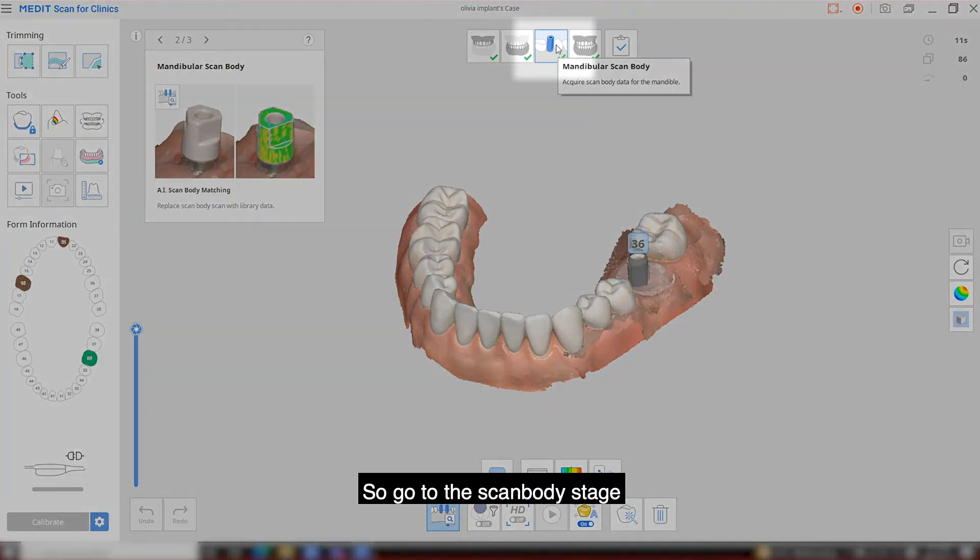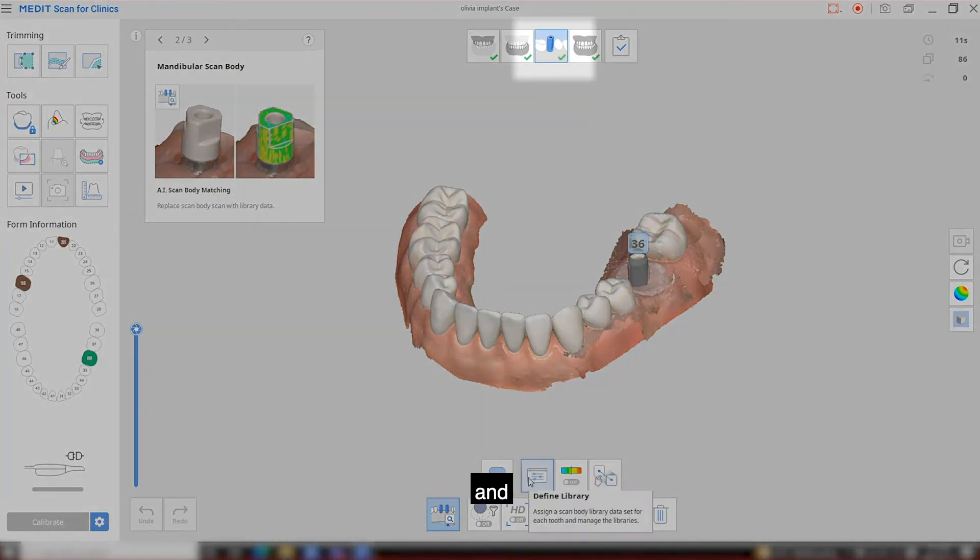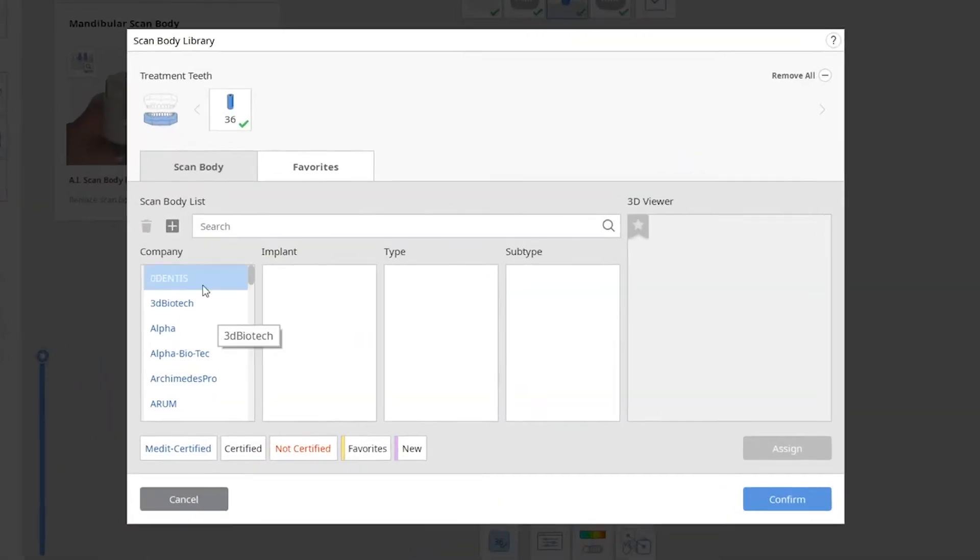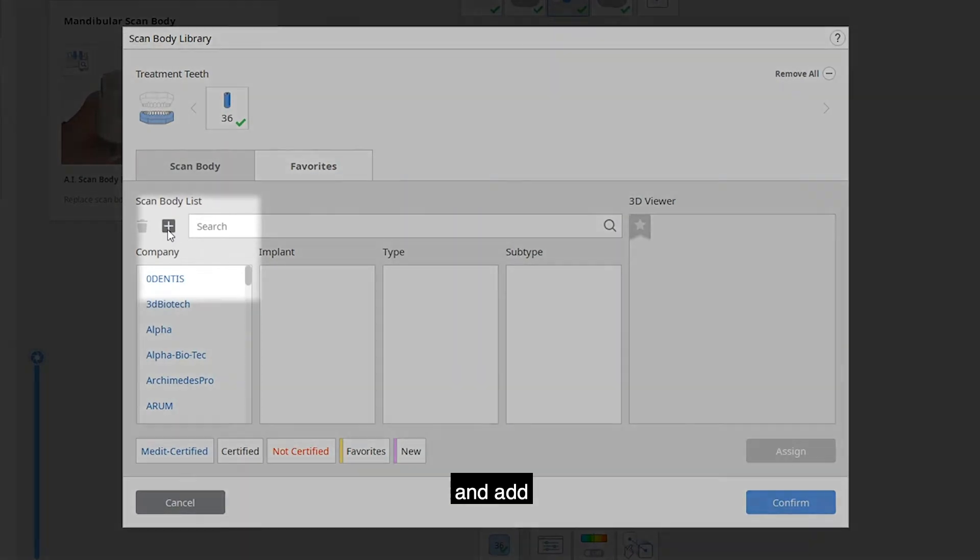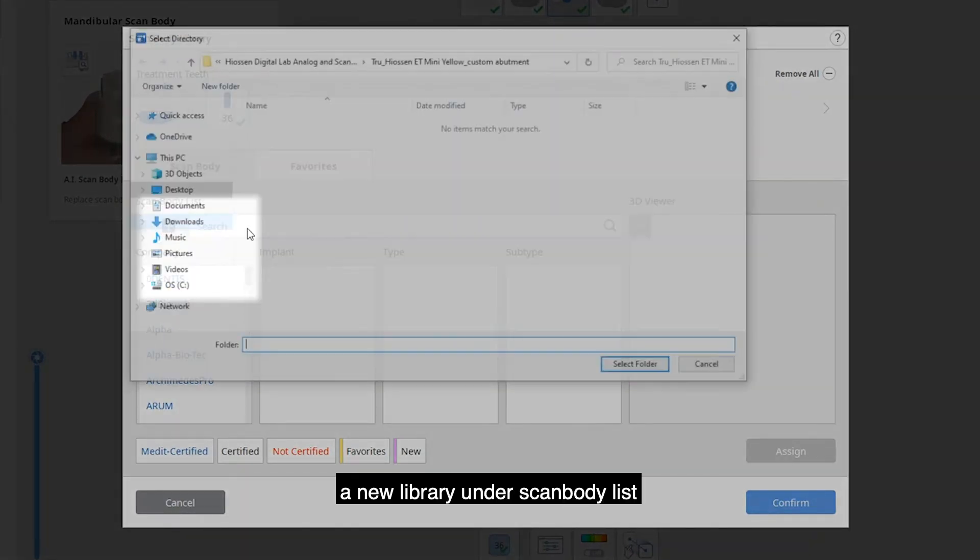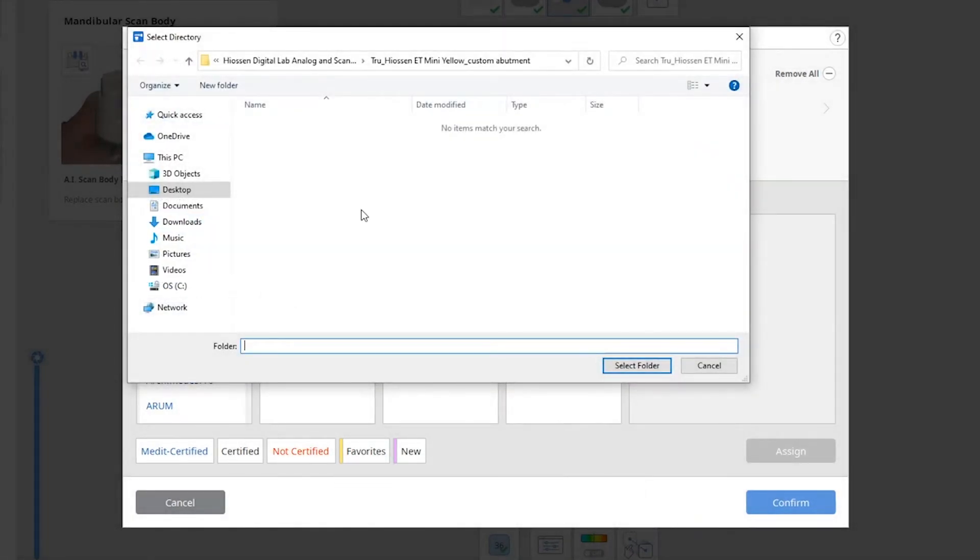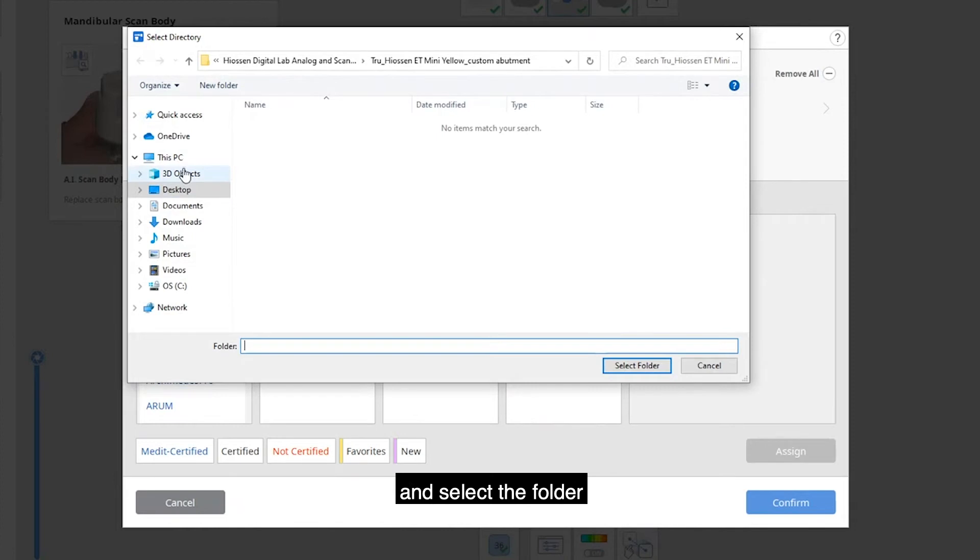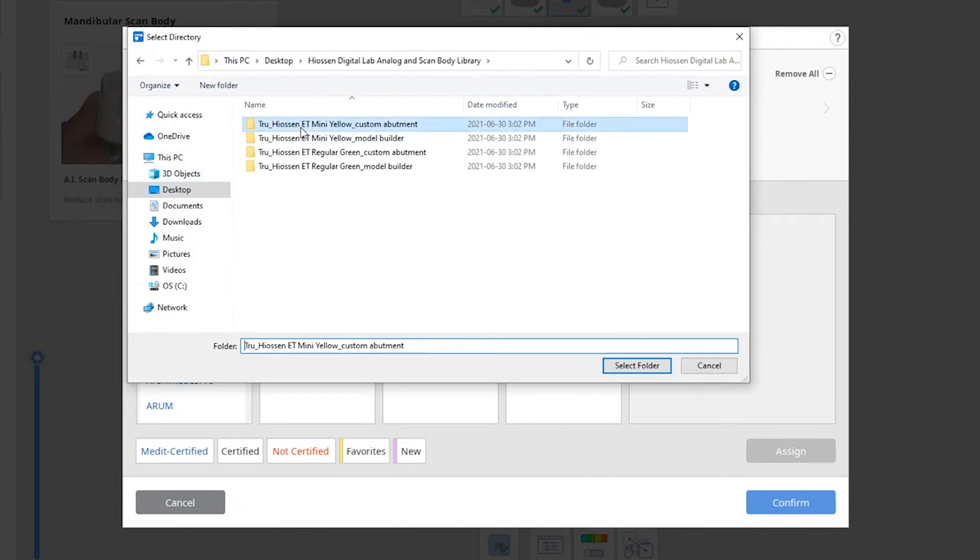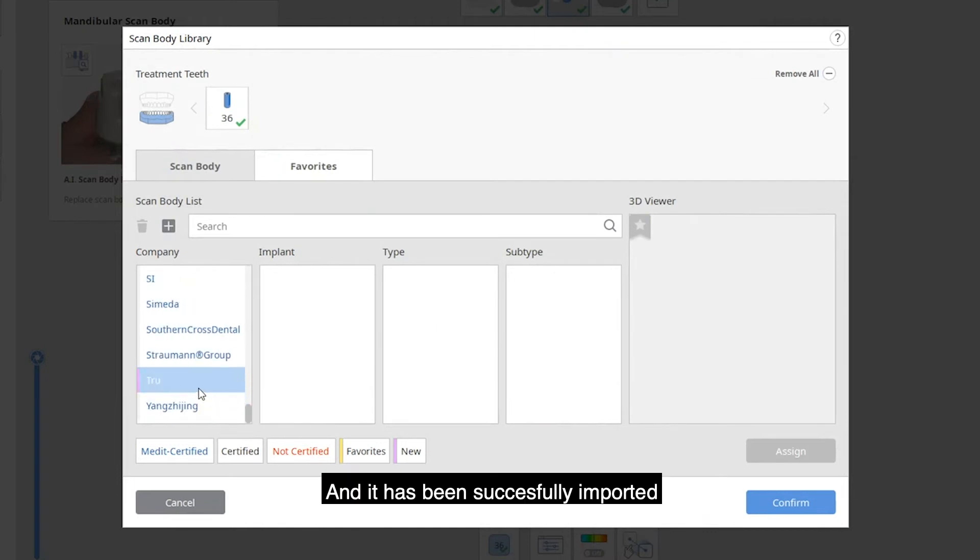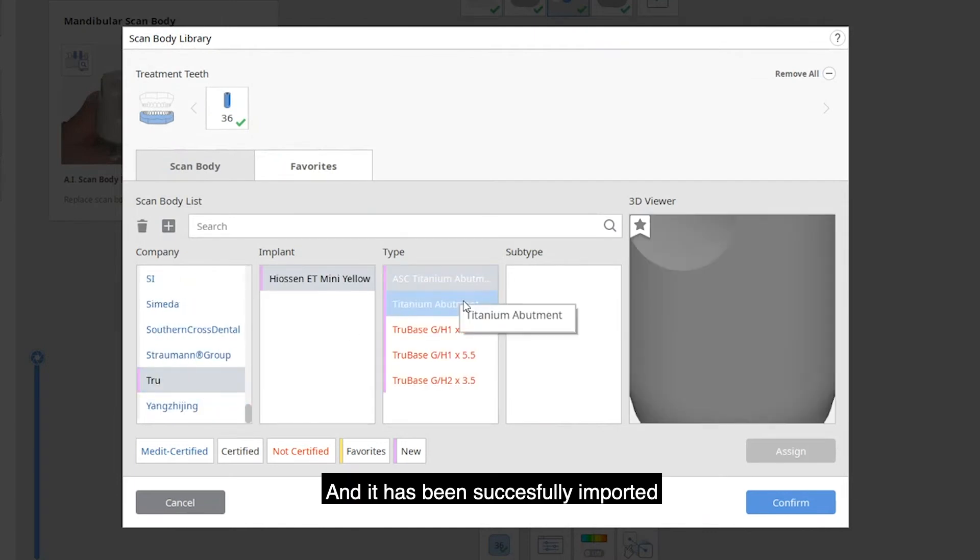Go to the ScanBody stage and click the define library, then add a new library under the ScanBody list and select the folder. And it has been successfully imported.